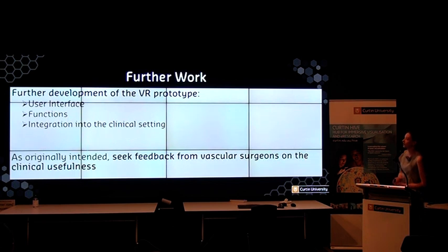So in terms of further work, there are a lot of hurdles that were encountered as we went through creating this project. Basically, a lot of software issues, things that the software couldn't handle or things that just hadn't been done before, so we had to overcome those and create as we went, which is why it's called research, I guess. So some of the further development that could be carried on would be to improve the user interface.